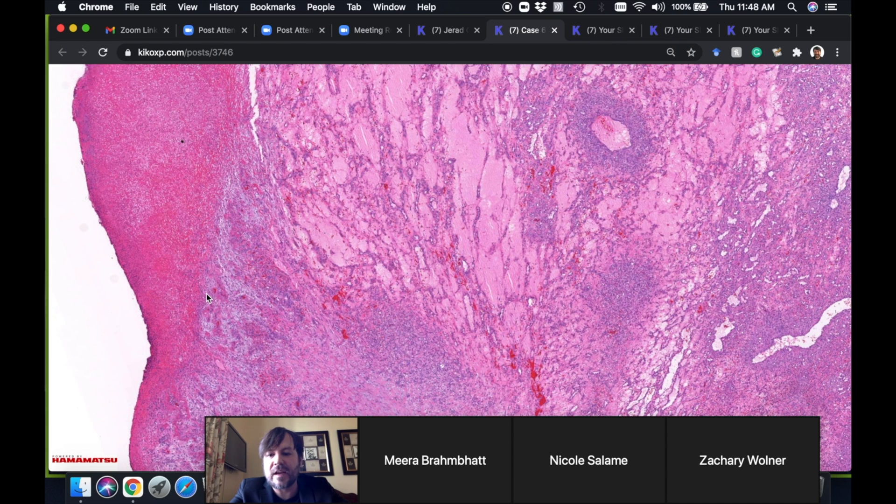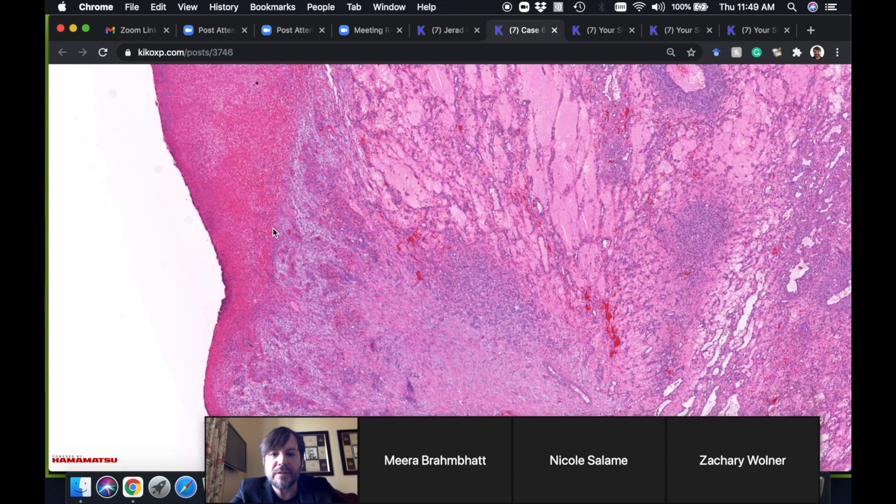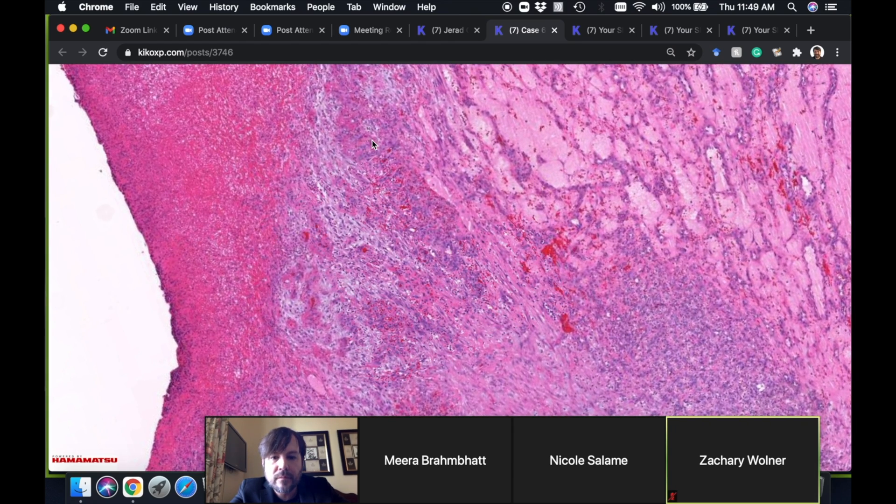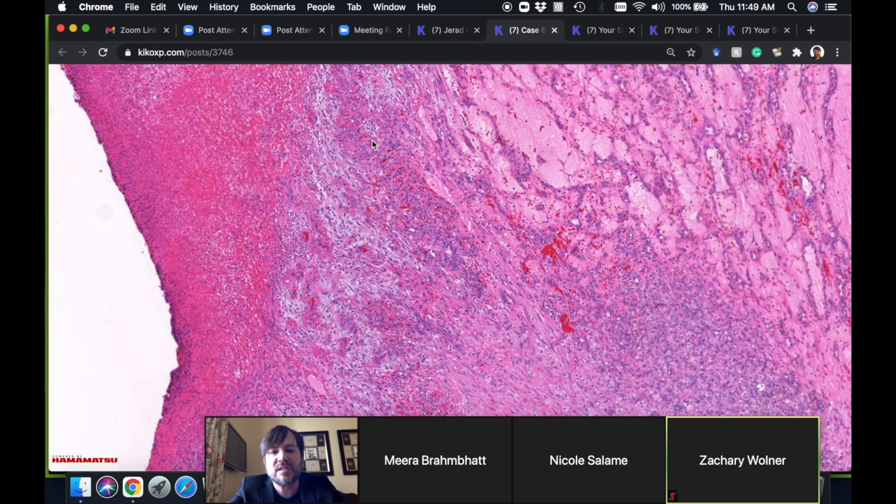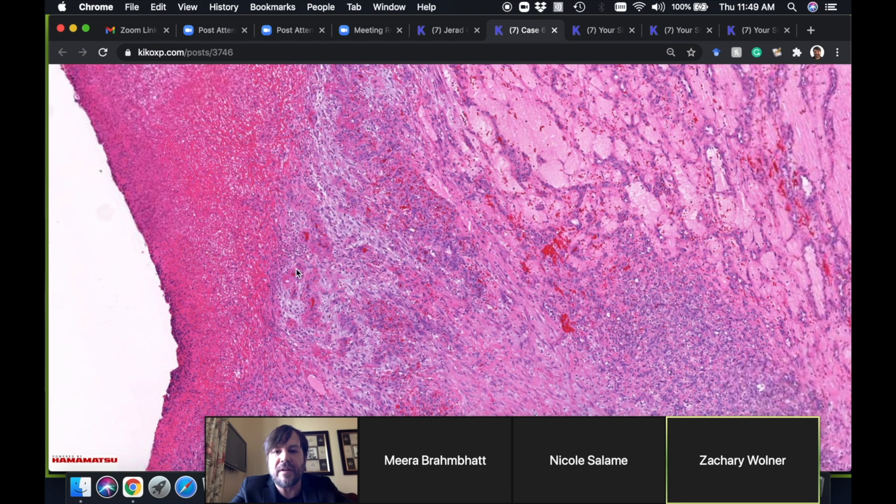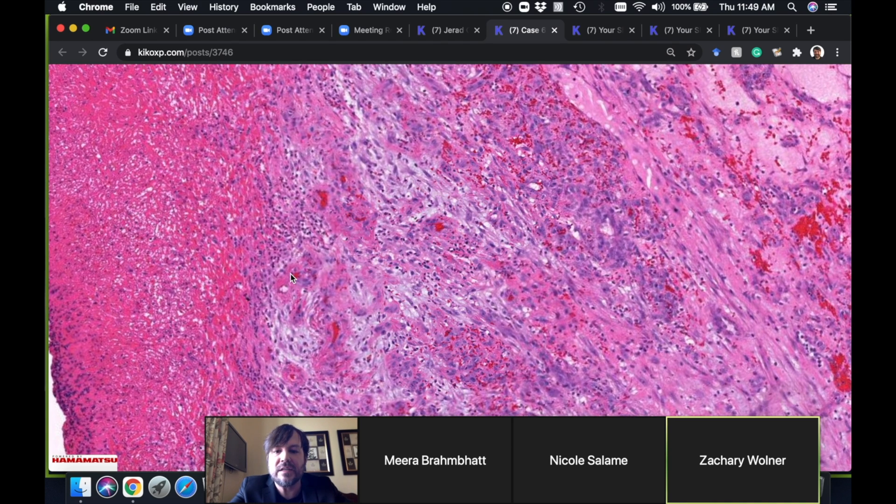If you start seeing a bunch of neutrophils down in the middle of something that looks like a PG, what other things should you think about? There's a rare thing that can mimic pyogenic granuloma but tends to have more neutrophils. Very good—bacillary angiomatosis.